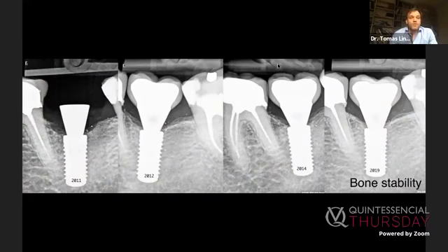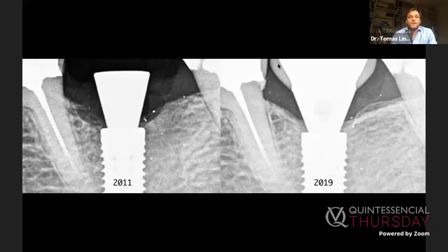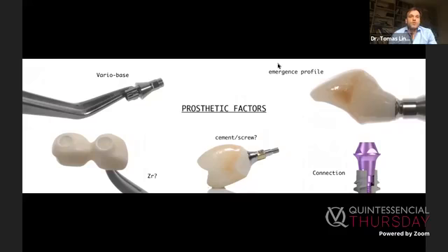And starting from the placement of the implant, till the follow-up. And again, we have a lot of proven things for how to keep the bone stable. So in my opinion, bone stability is not an issue anymore. And in the aesthetic area, of course, we need to have horizontal tissue thickness with the position of the implant, and that would practically be the major things.